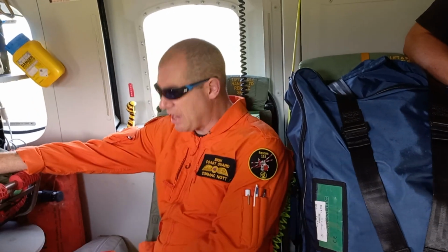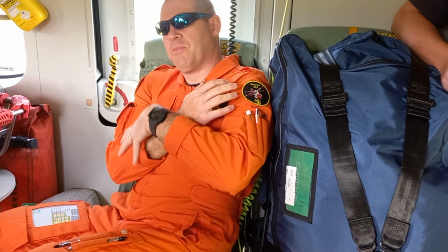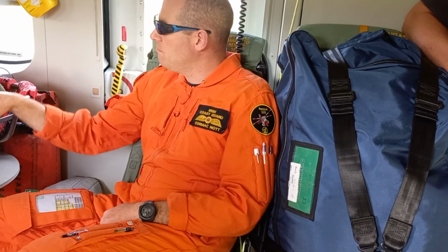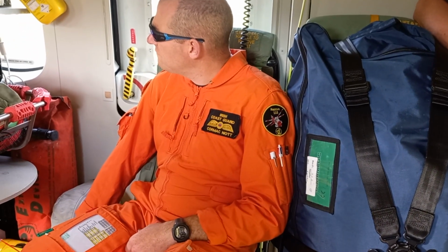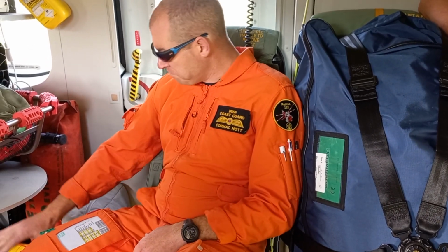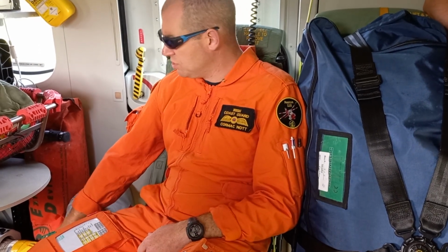For a splint around your ankle or your leg or your arm or anything like that, again, we shape it up around your arm, suck the air out, and it makes it nice and stable for when we're maneuvering around the aircraft. We have our drugs bag here. I think there's 23, 25 different drugs and medications in there. In that one, so that's the same as a paramedic on the ambulance service would use.